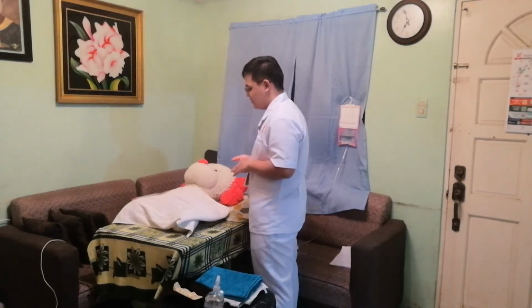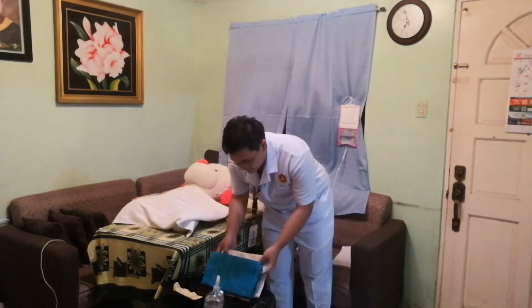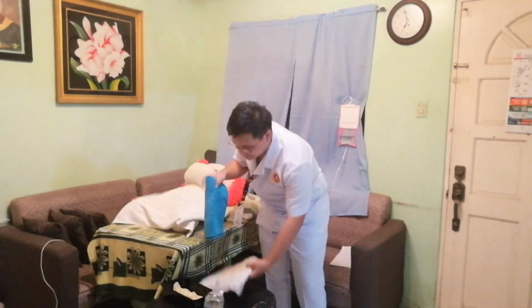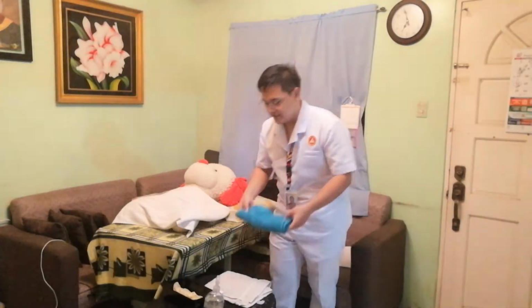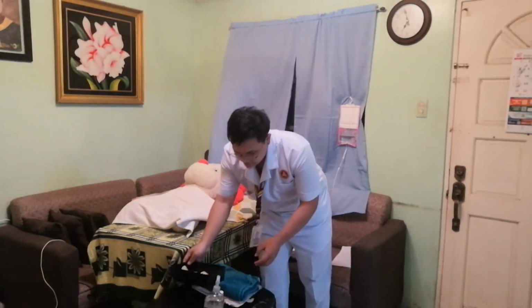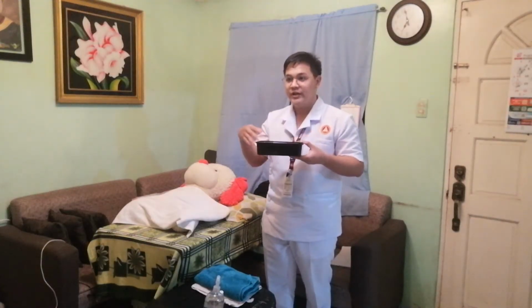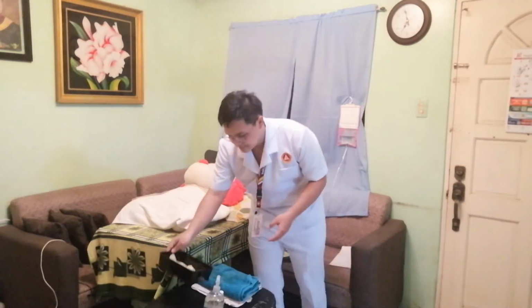So, for our next step, we need to assemble our equipment. First, for example, this is a disposable linen saver pad. Next is our bath blanket. Also, we do need to have, for example, this is a bedpan or a commode, but for this instance, we don't have a commode. Okay.